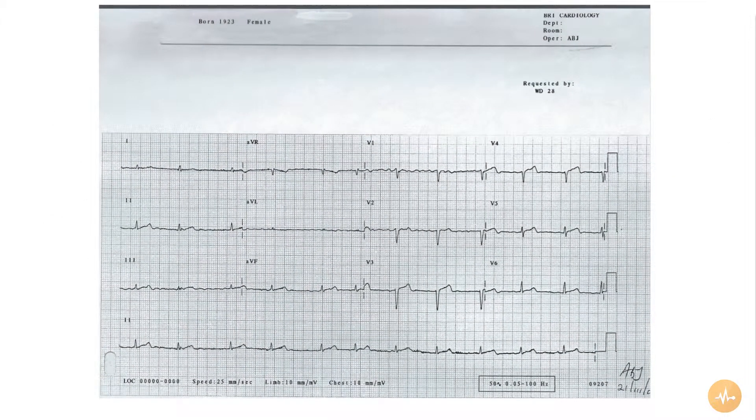This is an ECG recorded from a patient complaining of shortness of breath following a sustained episode of cardiac sounding chest pain.